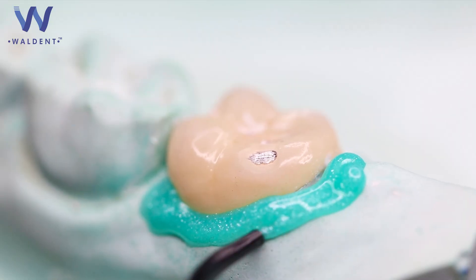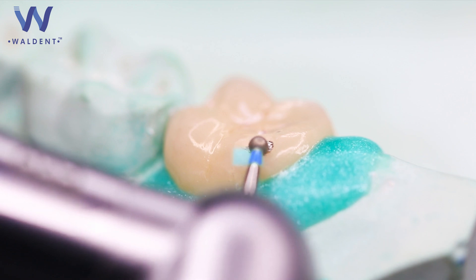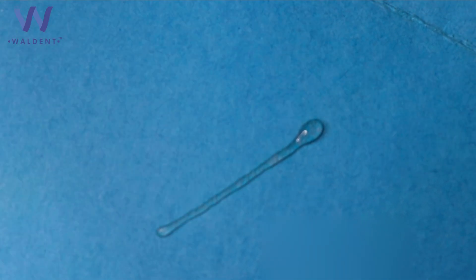Isolate the adjacent tissues with a rubber dam or gingival barrier. Slightly abrade the porcelain surface or exposed metal surface with a high speed diamond bur or micro air abrasion. Now attach the applicating tip to the Walden Porcelain Etch tube. Verify flow and consistency before applying.